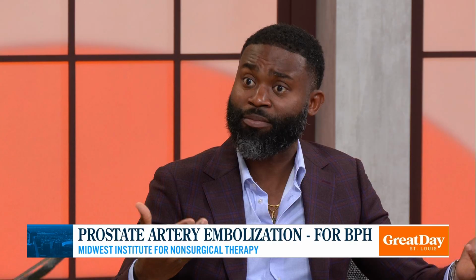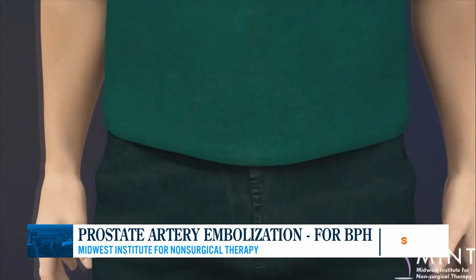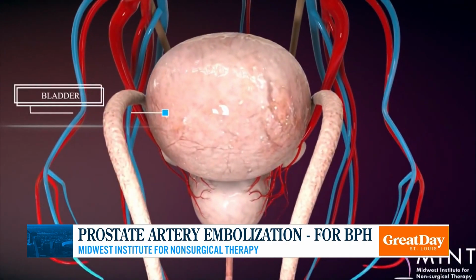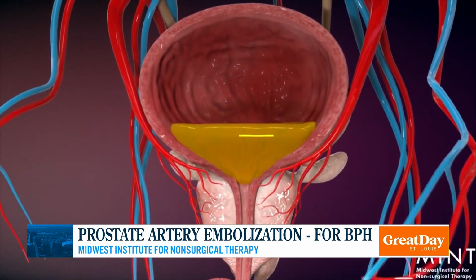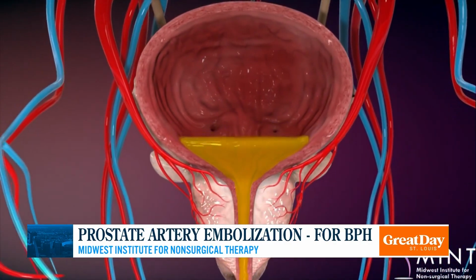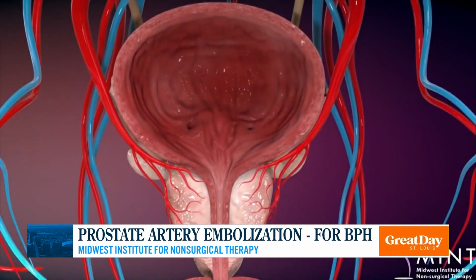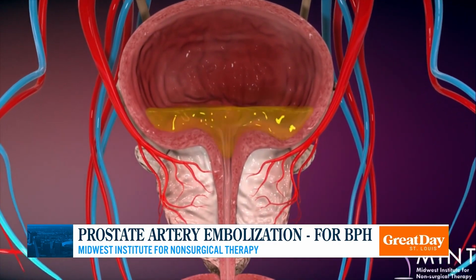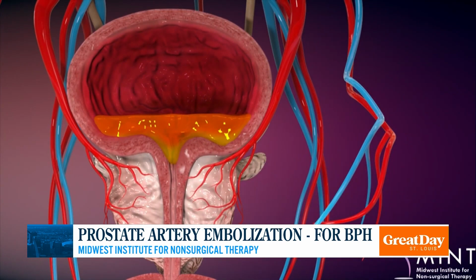No, so that's the reason why they ask for procedures that are less invasive, like prostate artery embolizations, which is what I'm trying to talk to you about. What is that? How does that differ from the treatment you just mentioned? So basically, we're going with a tiny little pinhole incision in the wrist. As you can see from the screen, we get down to the arteries that supply the prostate, and we basically embolize it. Embolization means slow down the blood flow to the prostate. What happens is that the prostate now shrinks, and when it shrinks, it allows that tube to get bigger and allows the urination to leave the bladder and come out.